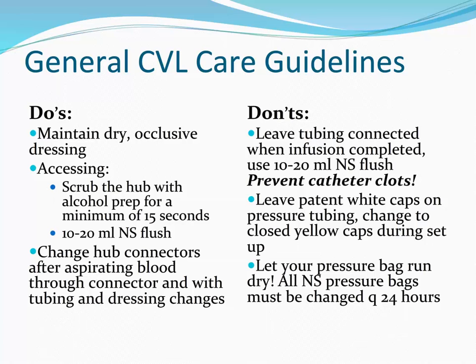These are all key considerations when trying to determine a root cause for the development of infection. We will review sterile dressing changes later in the program. There are some definite don'ts.